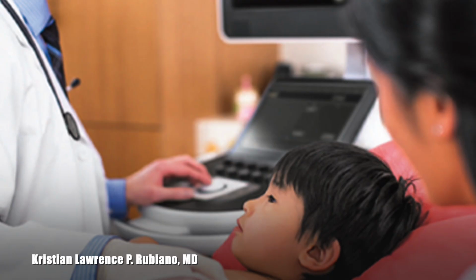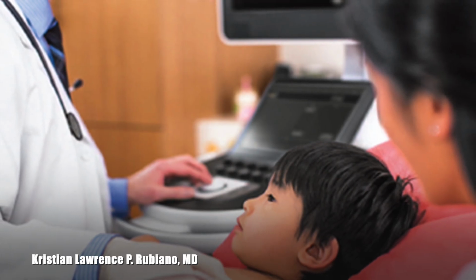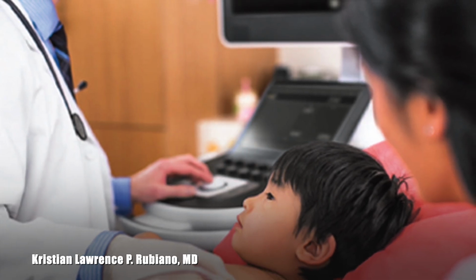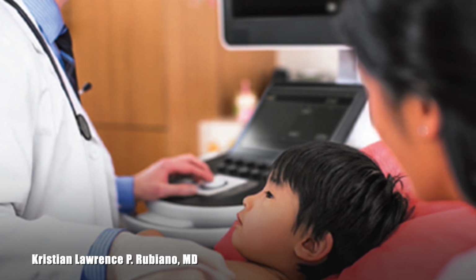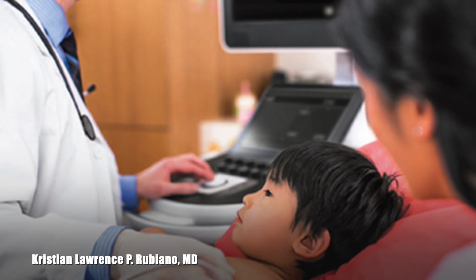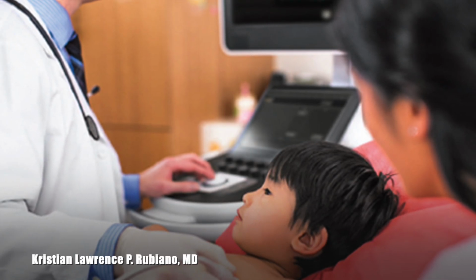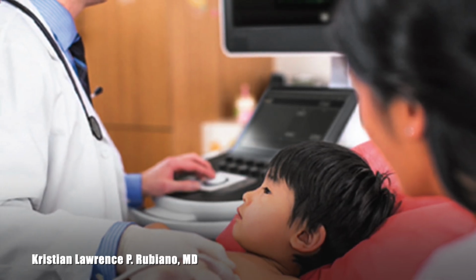In pediatric patients, it is important that a pediatric cardiologist performs the 2D echocardiogram, since the majority of the concerns in the pediatric population would necessitate thorough evaluation to consider or even rule out a possible congenital heart disease. Because of this, an in-depth examination is needed to examine cardiac anatomical structures.